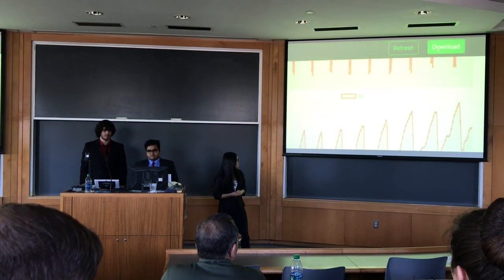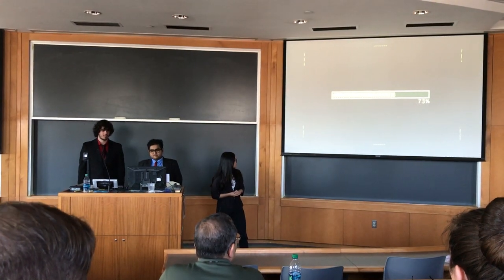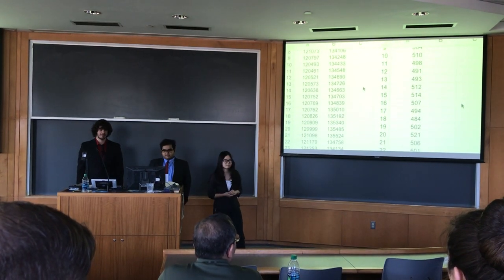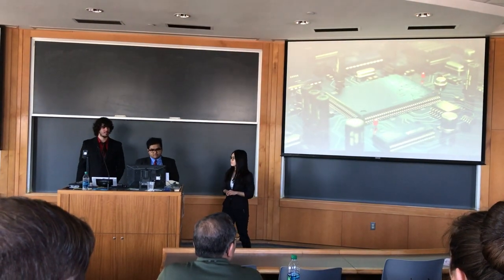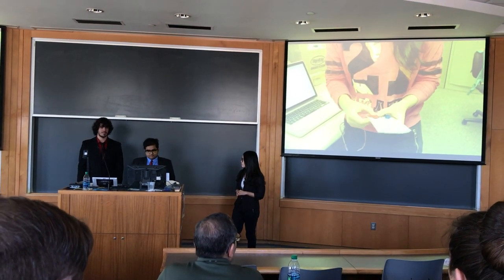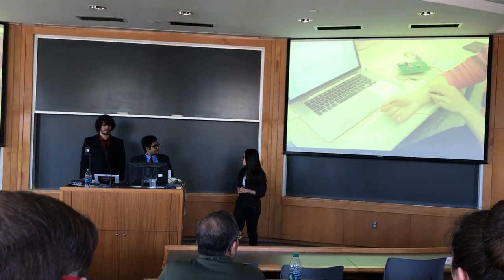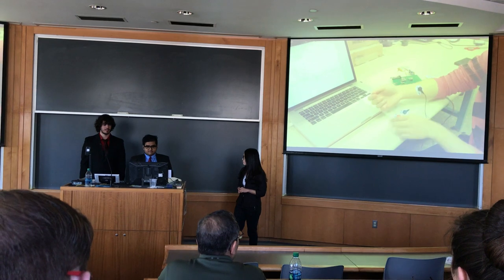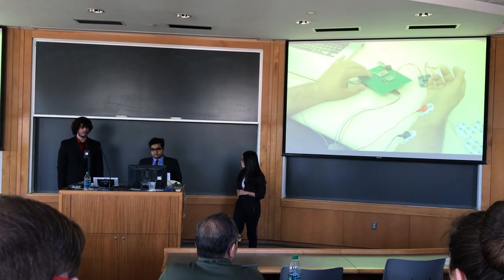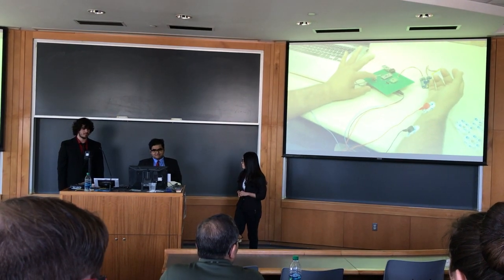We have also developed a way for a medical professional or researcher to download this healthcare data from the cloud and use their post-processing techniques to do further analysis and signal processing. We have come up with a fully functional portable solution that a doctor can carry around with them. This portable device can be connected to a laptop to record and visualize the patient's medical data. The previous technique of vital extraction can be applied to this data as well.